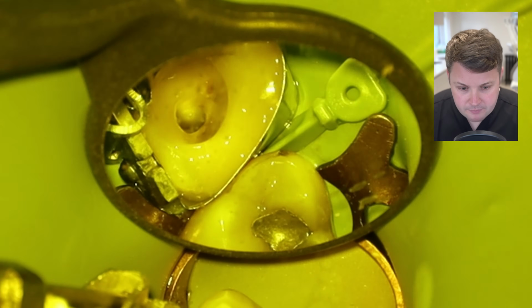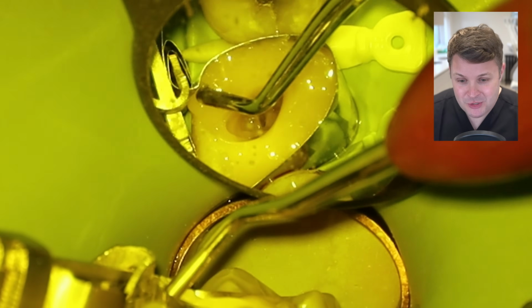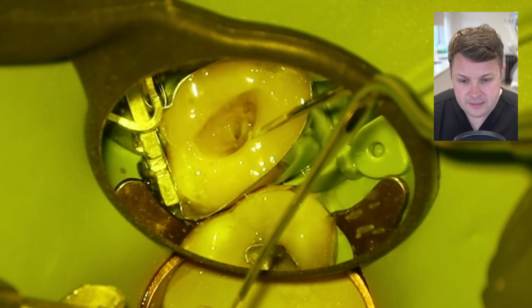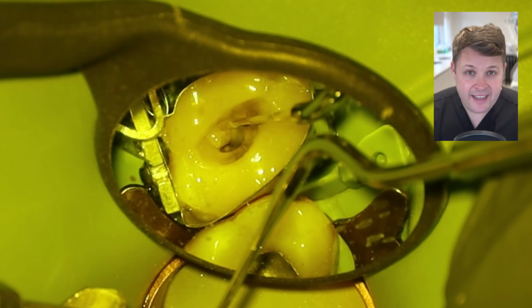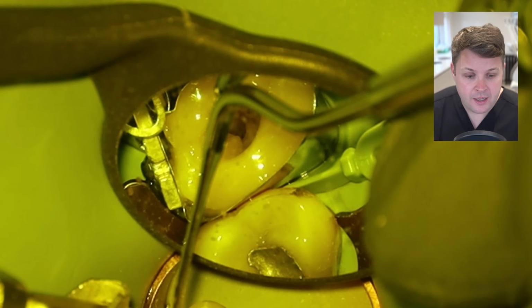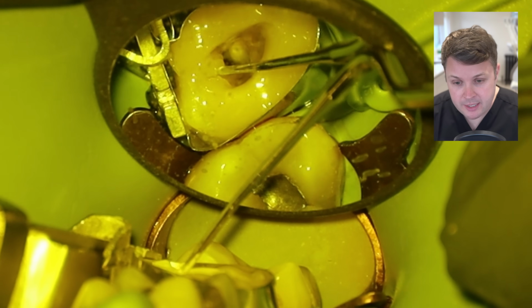And then another thing to be careful of is that when you place this composite, it doesn't go down the cavity where the pulp chamber is. I'm just going to use a DG16 endodontic probe just to remove some of the composite from this access cavity. You don't have to remove all of it because when you start to access this tooth, you'll be able to refine it, but sometimes it can be a bit difficult if you block it completely.